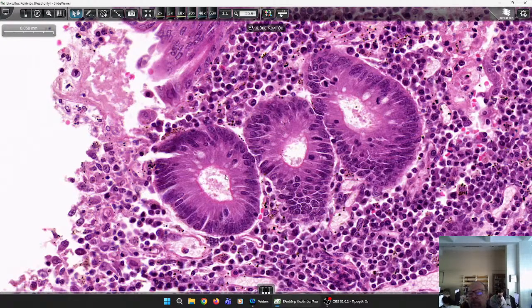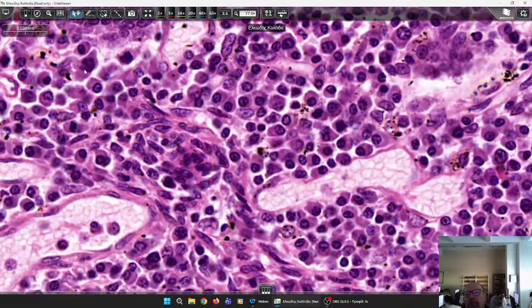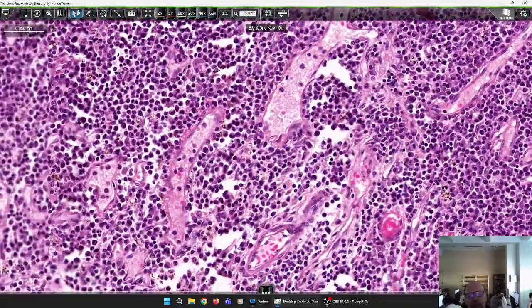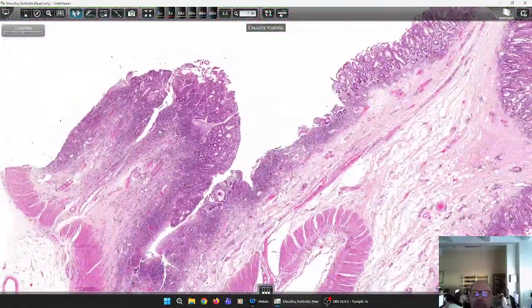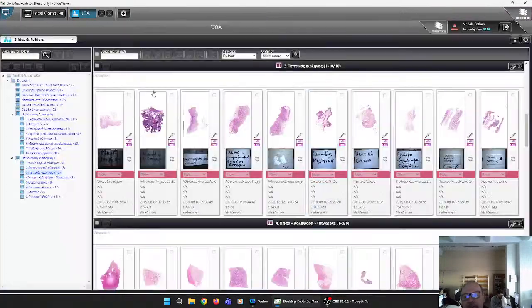And what else do we see here? We see all this increased number of plasmacytes, easily discernible. You see the plasmacytes, typical plasmacytes, which characterize the idiopathic inflammation of the bowel. So that was the slide of a chronically active ulcerative colitis.